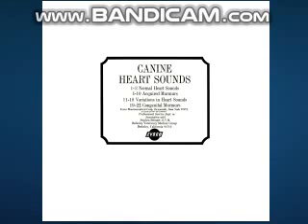Note the lower frequency of the first heart sound as compared with the second heart sound. Now, listen to the sounds of another normal dog recorded over the mitral valve location.